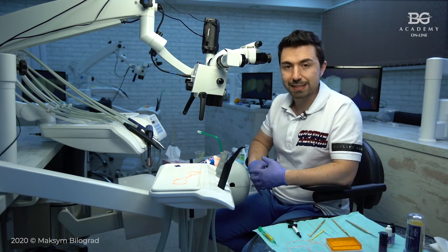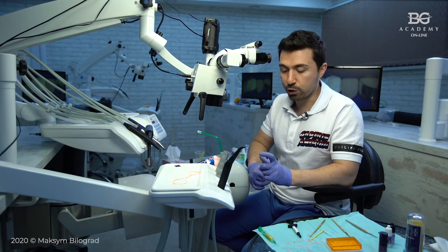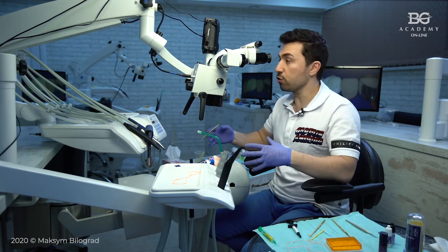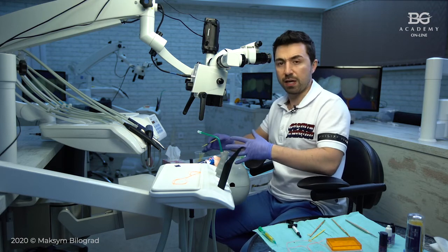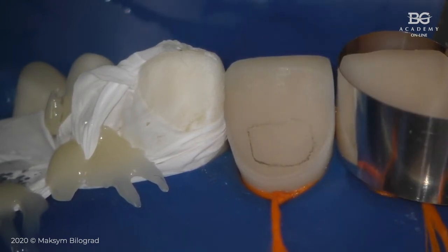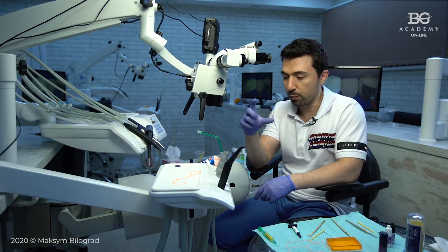If you are using 6th generation of adhesive system, which is a self-etch, but classic self-etch, when you still have acid primer as a separate bottle and adhesive as a separate bottle. In this case, once you dry the surface, you take still primer, you do 20 seconds priming in dentin area, dry, and then you take your bonding agent and you put your bonding agent all over surface of enamel and dentin.